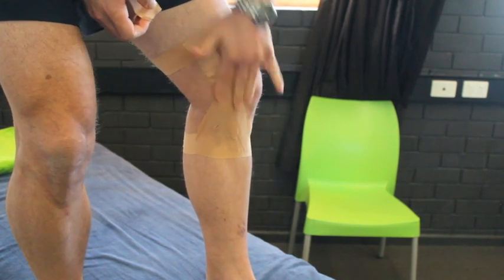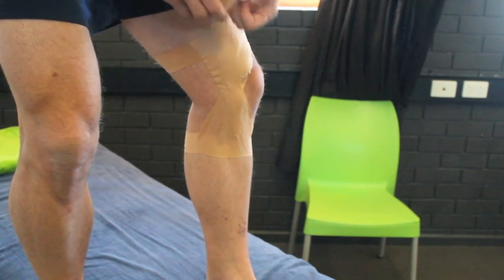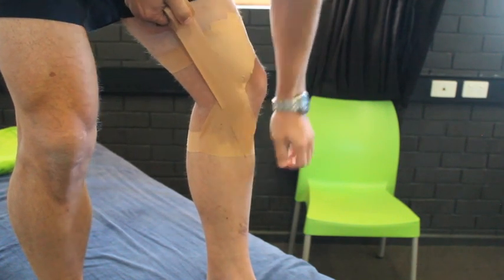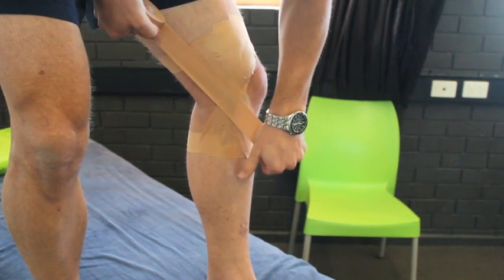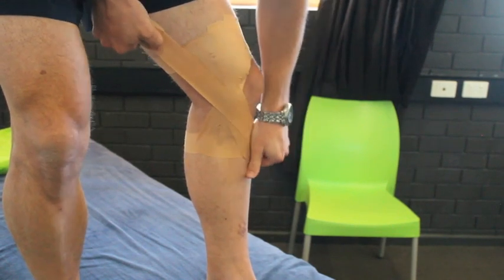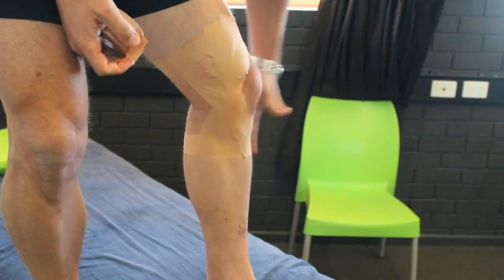At the moment I've crossed them over and we've got about a tape width's worth of coverage. If you want more coverage you can just bring another one across to the side or fan it out from a different point — as much or as little as you require.